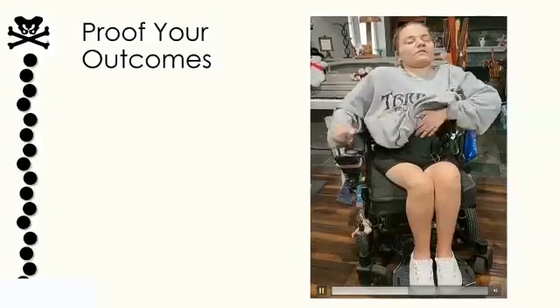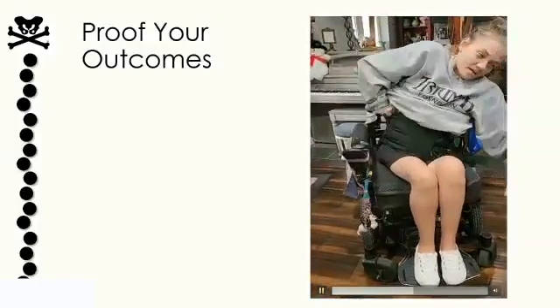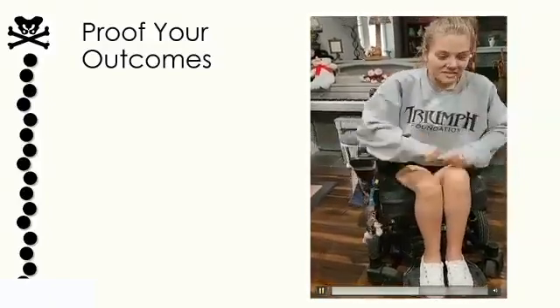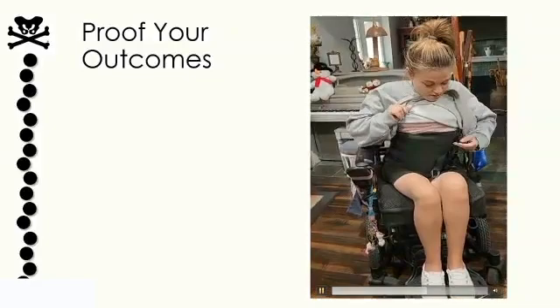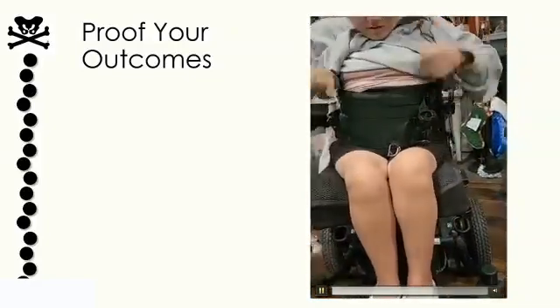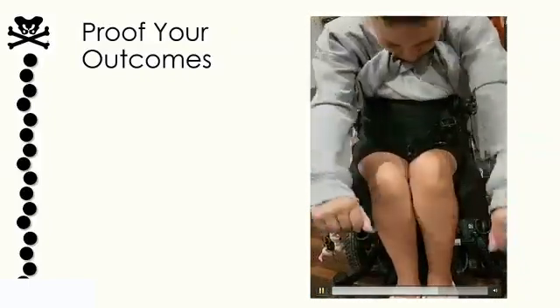So she has now gained the ability to drive. That's the biggest concern with this: can I get my full ability to steer the steering wheel, and can I reach and do my things? So she loosens up the straps and pushes it below her rib cage. Then she can lean over the top, as you see, and that will give her the function.